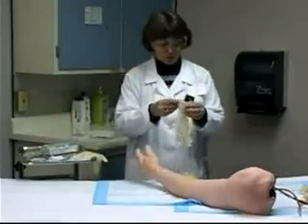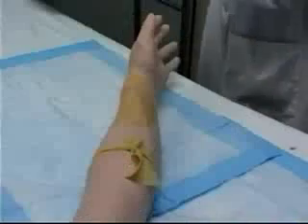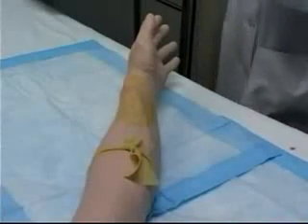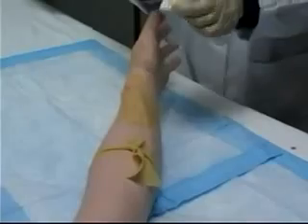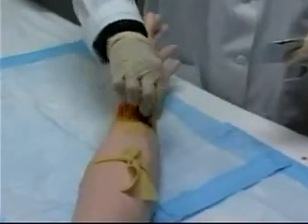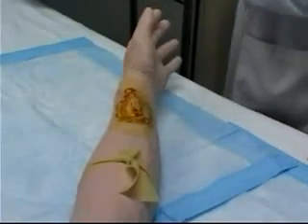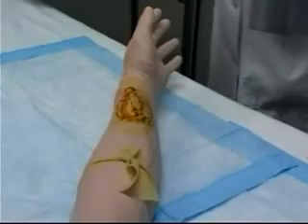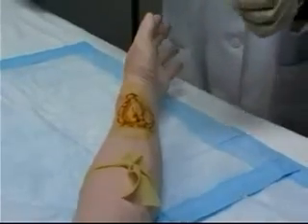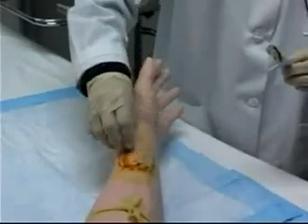Okay, now I'm ready to do the actual procedure, so I'm going to put my protective gloves on, and I can now clean the area. The first cleaning is with the Povidone iodine. Open the package, clean the area and a little beyond in a circular motion. Once that's dried, I can clean the area once again, this time with just a plain alcohol swab.